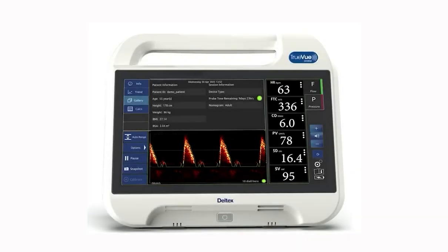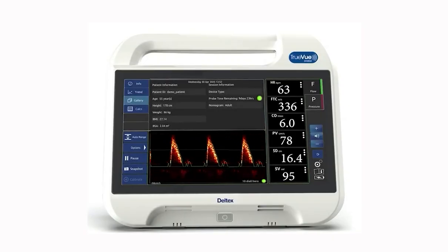The descending aortic signal is the tallest, brightest waveform above the line, with the loudest, sharpest whip crack sound, incisors near to markers 1 or 2, or nostrils near to markers 2 or 3. Note this position to find the signal easily again. Recheck at different depths to ensure the optimal signal has not been missed.